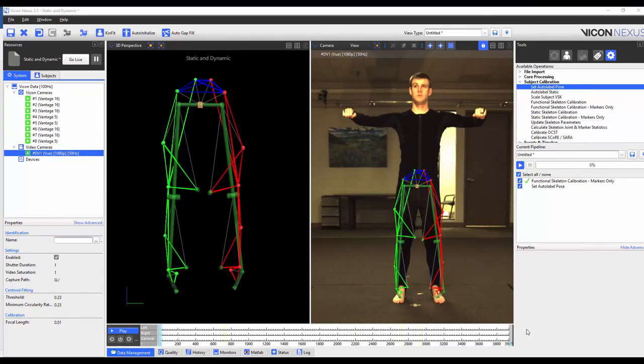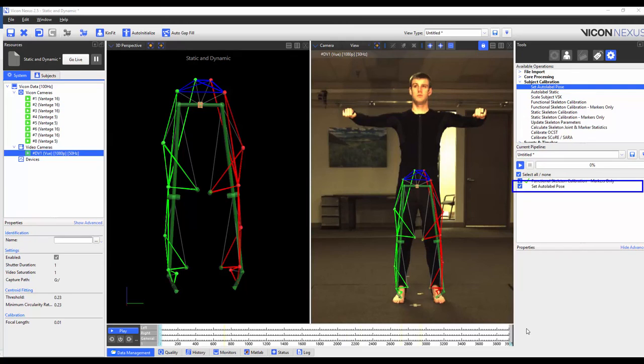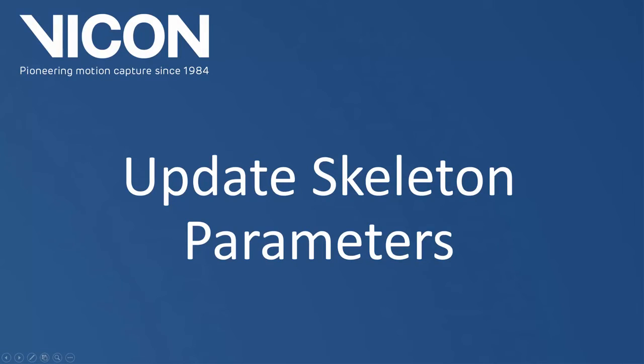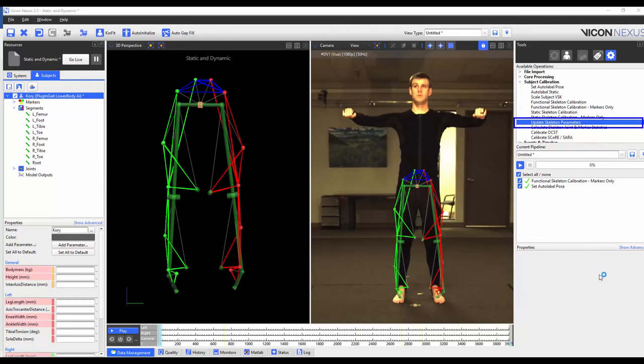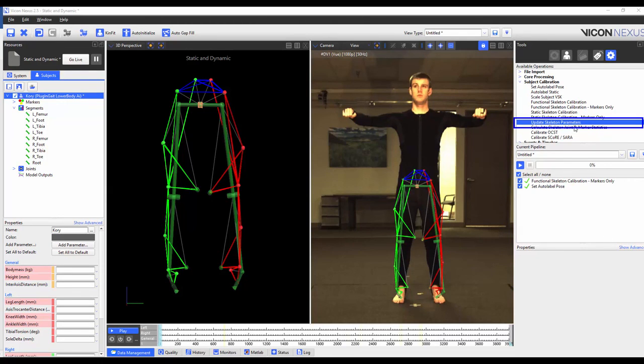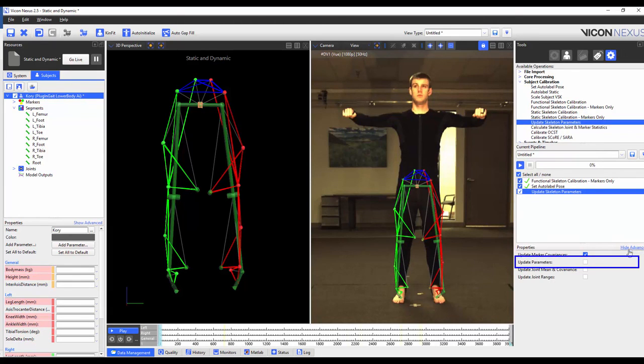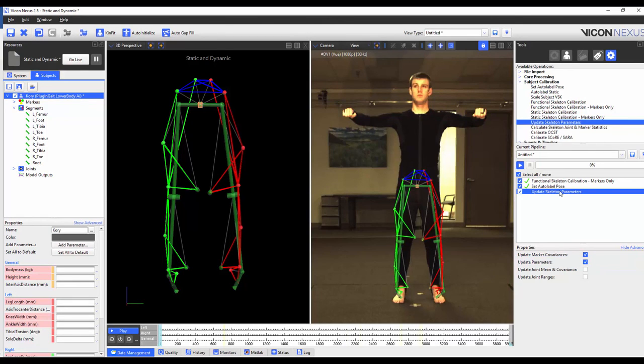We are now going to make sure that we're on a frame where the subject is standing in the base pose. We're then going to execute the set auto label pose pipeline operation so that we can try to use the auto label function for other subjects. Finally, I'm going to load the update skeleton parameters pipeline operation into my current pipeline. I'm going to highlight it, press show advanced, and make sure that update parameters is checked. And then I'm going to execute the operation.